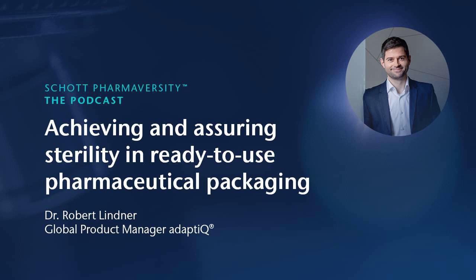Mm-hmm. And how can sterility be measured and assured after the sterilization cycle? So measuring the sterility is not easy, or not really possible. What is typically done, and what is accepted, is that the efficacy of these sterilization cycles is measured with biological indicators.